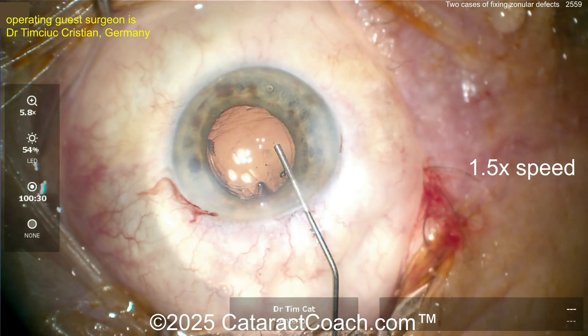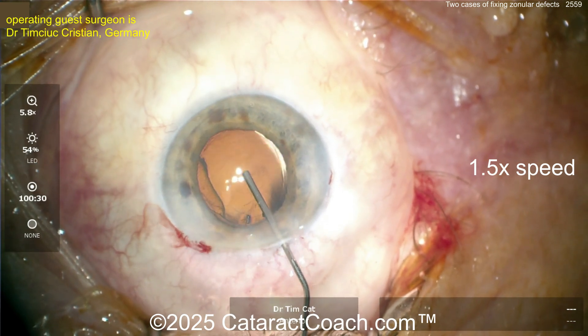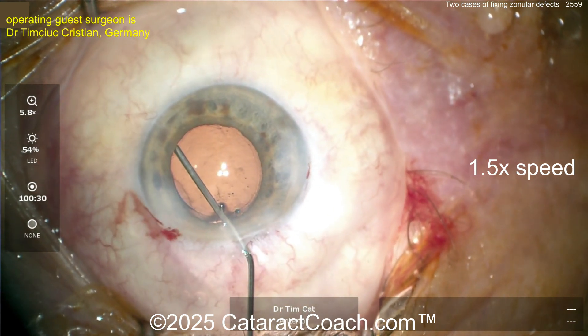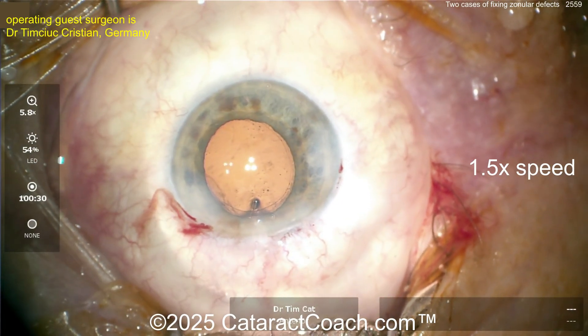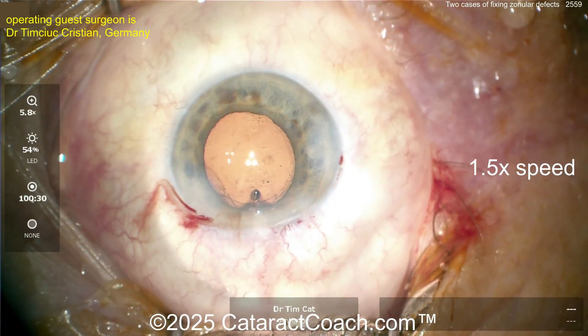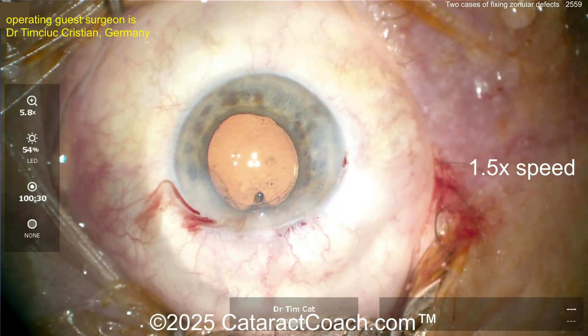Now viscoelastic is going in — a smart move — especially to lift up that rhexis edge. And what's going to go in next is a capsular tension ring. You definitely need to know how to place the CTR. More viscoelastic to fill the bag; get the CTR ready — we're going to place it inside the eye.